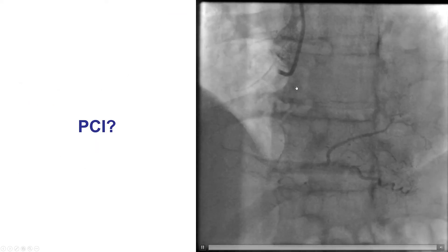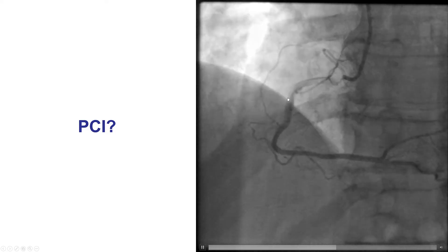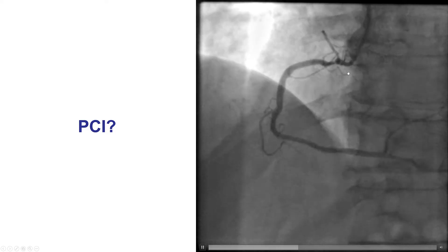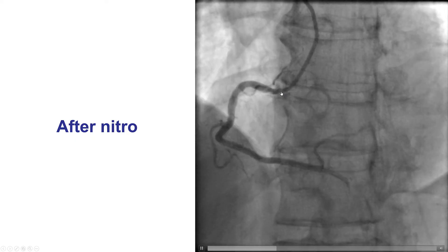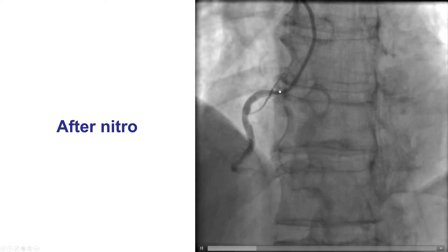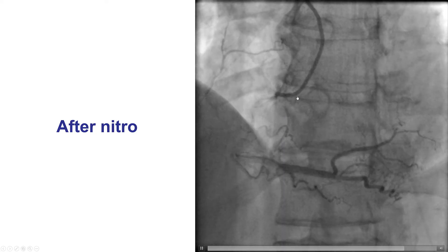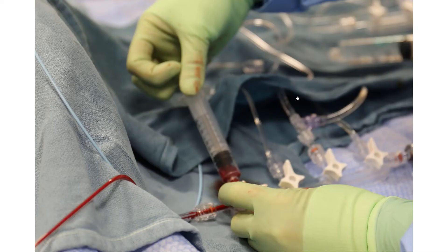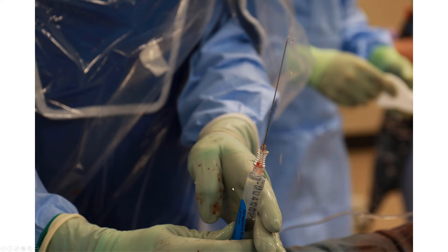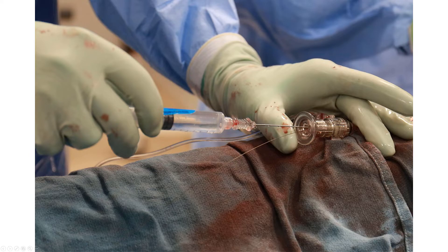This is why nitroglycerin is important. This is angiography of the right coronary artery showing a significant osteal lesion. However, after nitroglycerin was given, there is no significant lesion — this was all spasm, likely due to manipulation of the catheter to engage the right coronary artery. So nitroglycerin should be given whenever possible before coronary angiography. The way to give it is either on the side port of the manifold, aspirating and then injecting the nitro. Another way is to use the nitroglycerin-on-the-stick technique, in which the nitro is injected through the introducer directly through the back end of the wire.